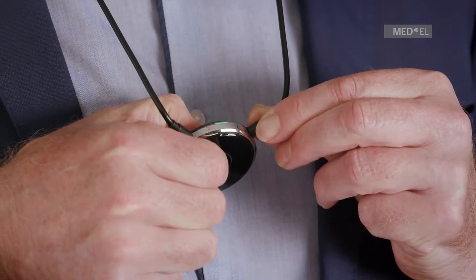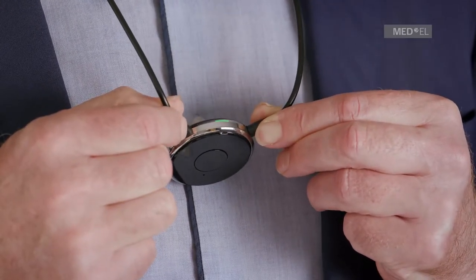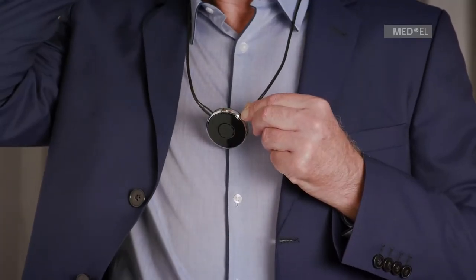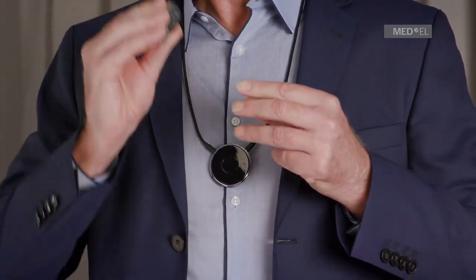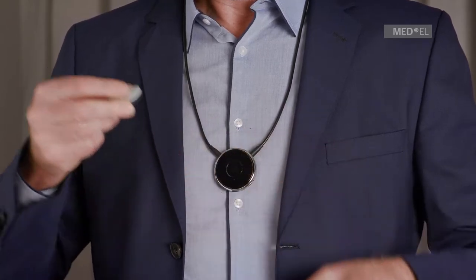Press the multifunction button on Samba2Go until the green LED turns on. The green LED will flash while searching for audio processors nearby. If you have not yet paired a Bluetooth device, the blue LED will also flash.